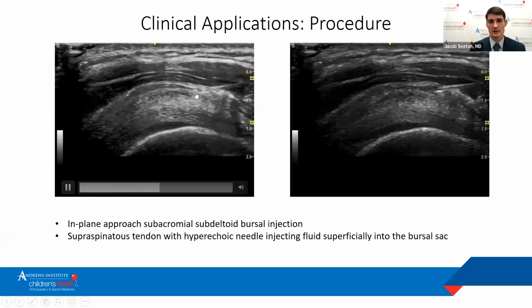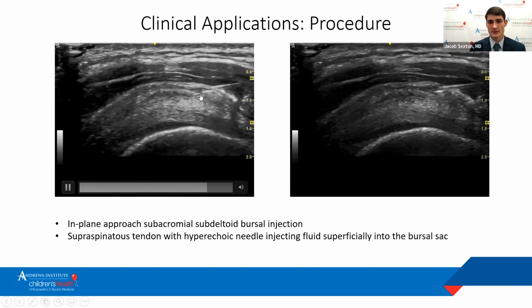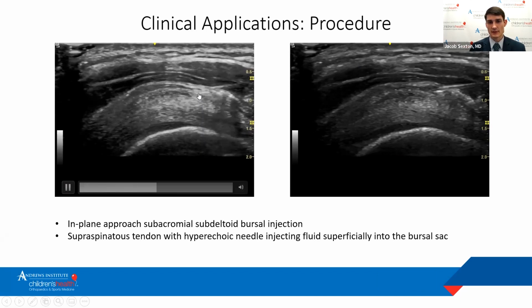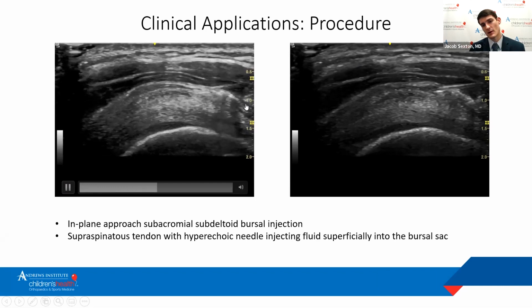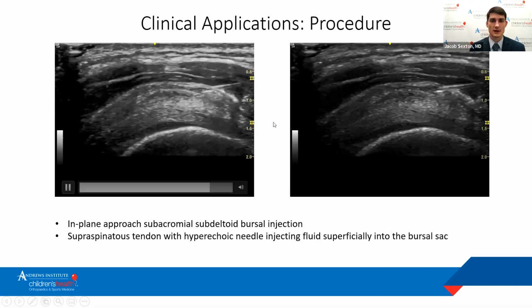As you can see, when you first start, it looks like I'm putting it into the tendon because my needle tip's a little bit deep. And so then I just retract a little bit. And then all of a sudden you see this bursa lining open up. And then you see the fluid, the medication, spilling over down into the bursa site. So I know I'm in the bursa at that point in time.